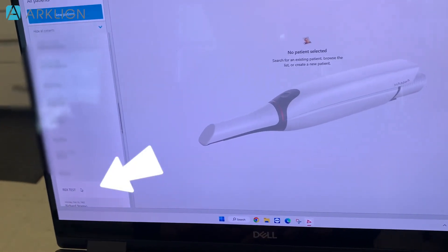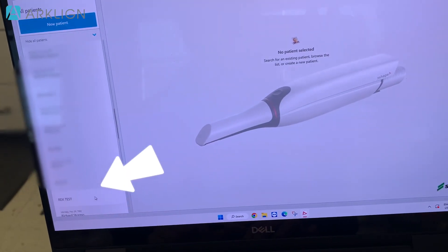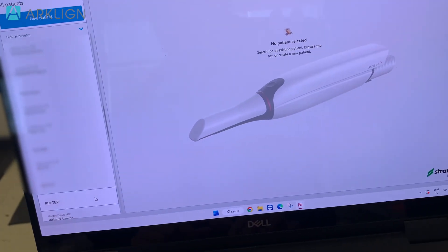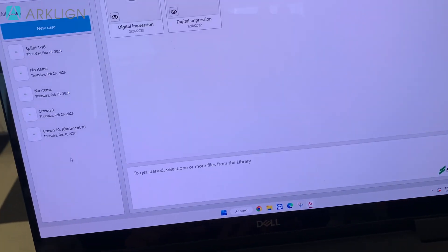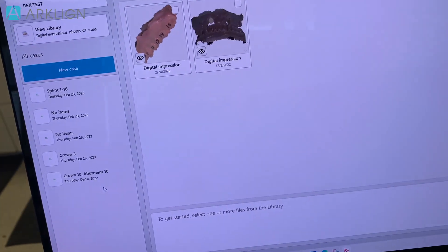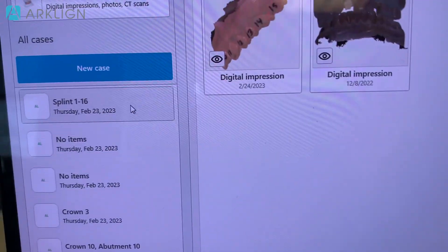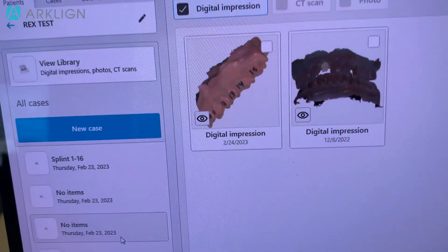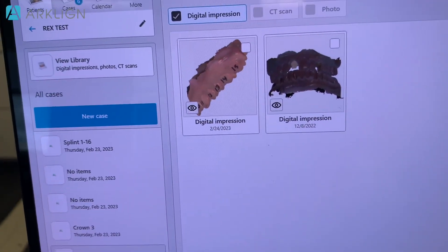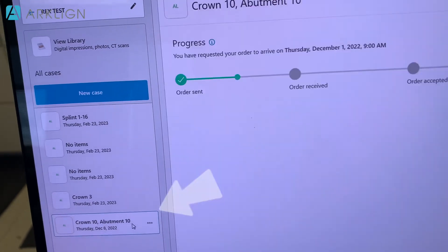You look for the patient that you want to export. You click into it and then here's all the files of the scan that you did for this patient. I'm going to look for the one I want to send.